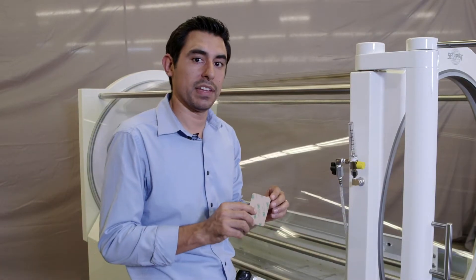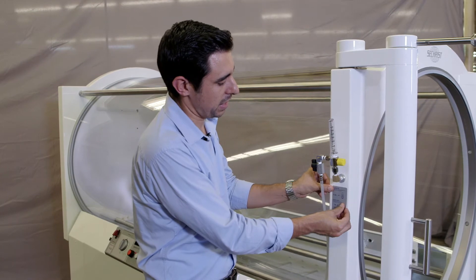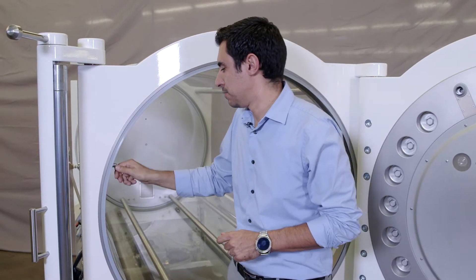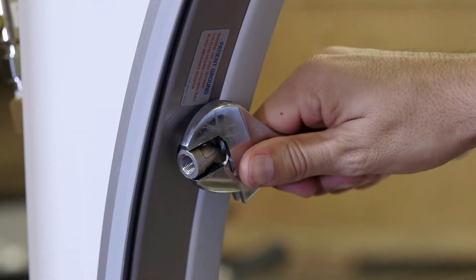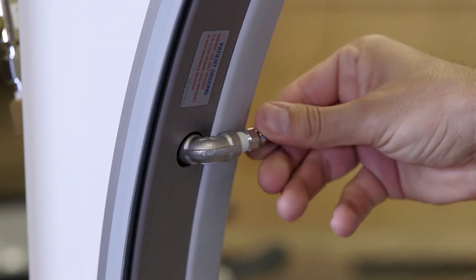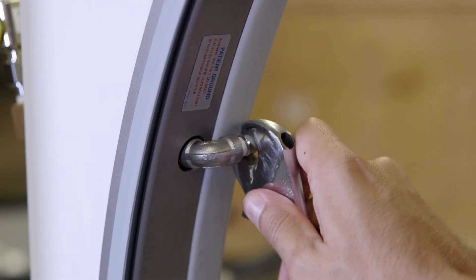Peel off the back of the adhesive label and apply it to the chamber underneath the air brake free flow assembly. Install your elbow fitting to the pass-through fitting from the air brake free flow assembly as shown. Use a crescent wrench to fasten in place and align towards the rear of the chamber. Install your bubble barb fitting to the elbow fitting and secure using a crescent wrench.